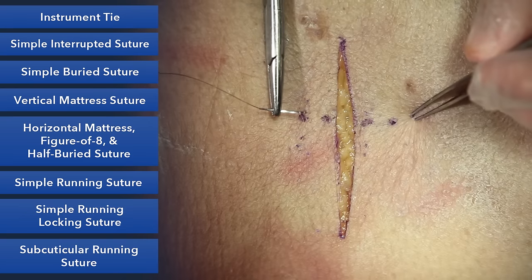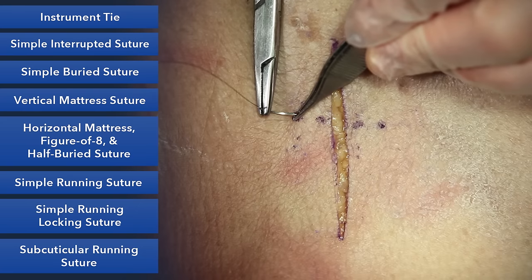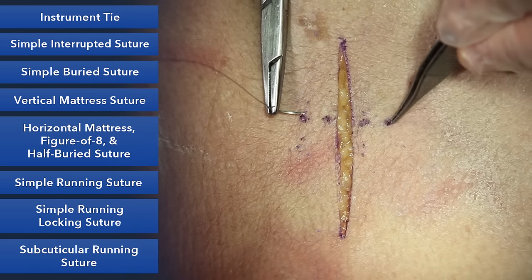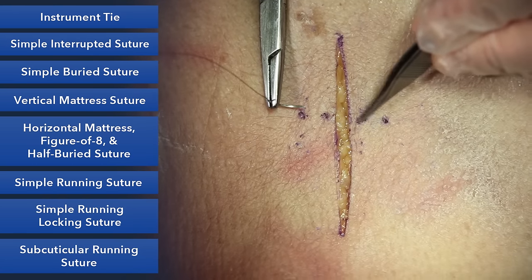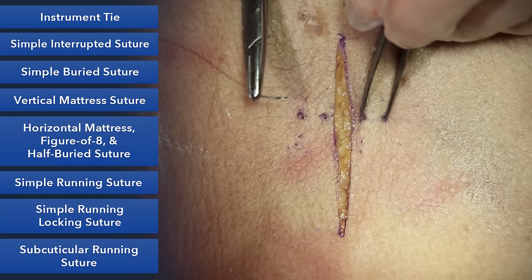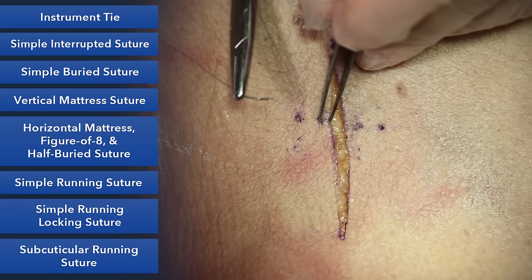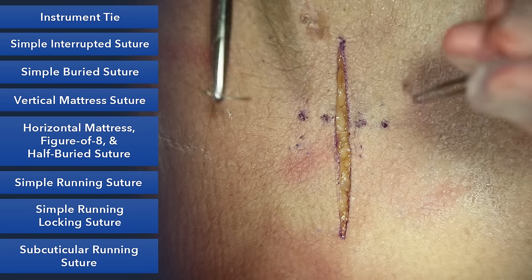Some will call this the far, far, near, near stitch, and this is the configuration of your suturing. We're going to enter far from the wound, travel under the skin, come out far, and then come back and go near, near. Essentially, you're taking this part of the skin and closing it to this part of the skin, and that's the power of the suture. The simple suture is really relying on a much smaller area.